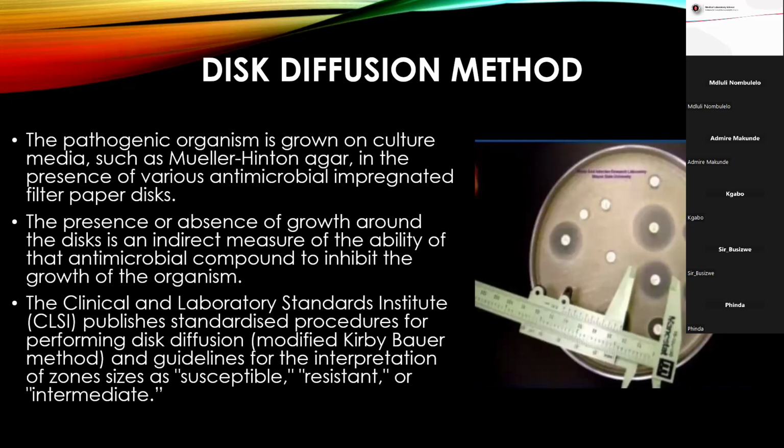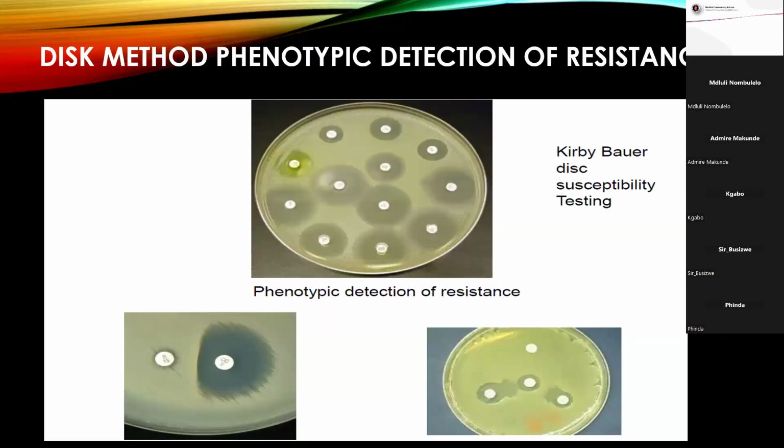Some antibiotics need 24 hours, like, for example, the interpretation of vancomycin disc AST: it's a must, you have to read exactly 24 hours after incubation. Other antibiotics, it's 16 to 18 hours. So the guideline will explain which duration you need to use.